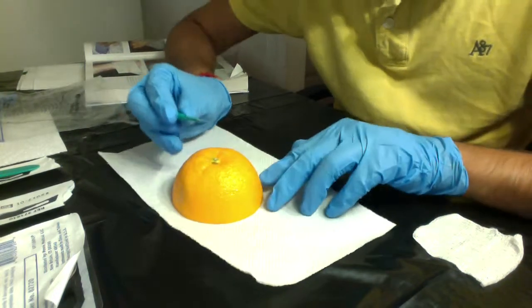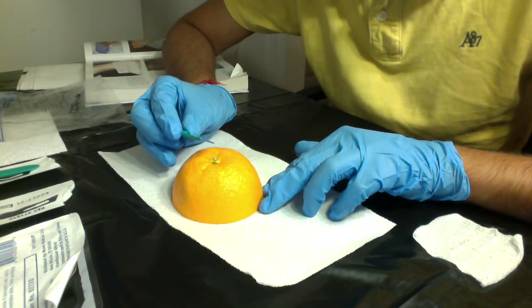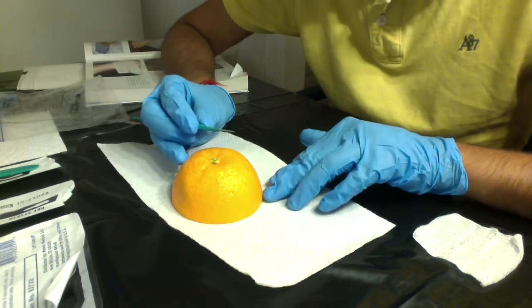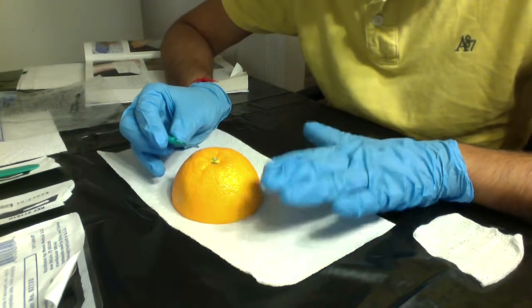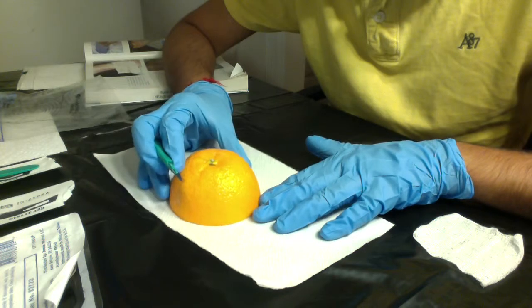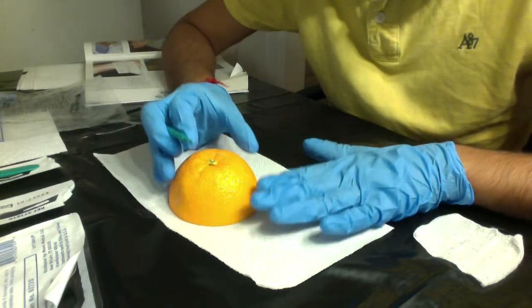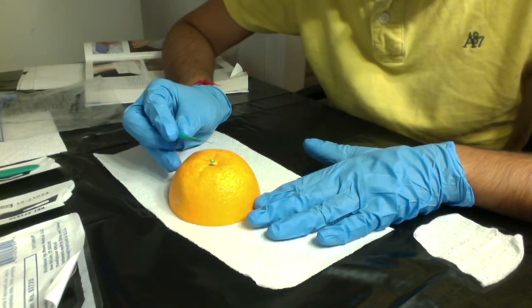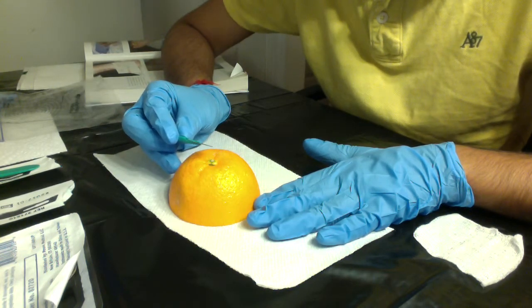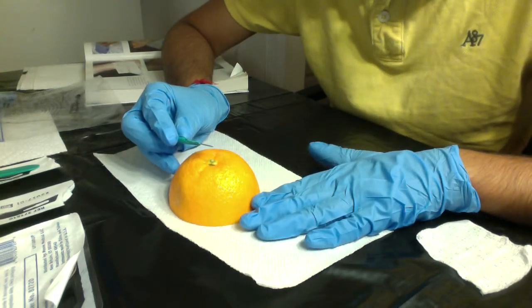Now the things which we have to take care of is to make sure that we are not cutting through the viable white tissues of the orange, and I'm not using the ham hock because of particular reasons. I'm using the orange, the navel orange, and I'll be demonstrating all the procedures on the orange. So I'm starting with shaving and paring process, which basically shaving can be used for callus shaving and paring.